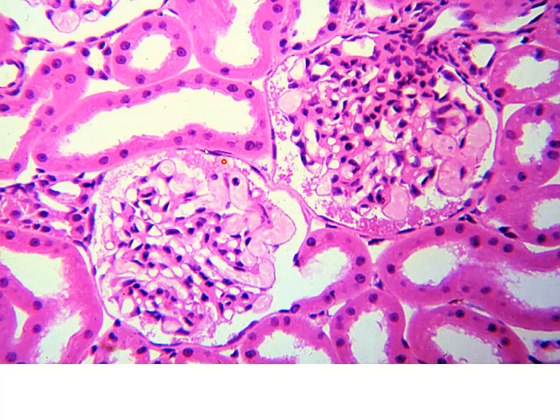But what we're looking at in this particular renal corpuscle, you can see the parietal layer, you can see the glomerulus, but notice how we go right into a proximal convoluted tubule. That means that this area we're looking at, this is going to be the urinary pole for this renal corpuscle.